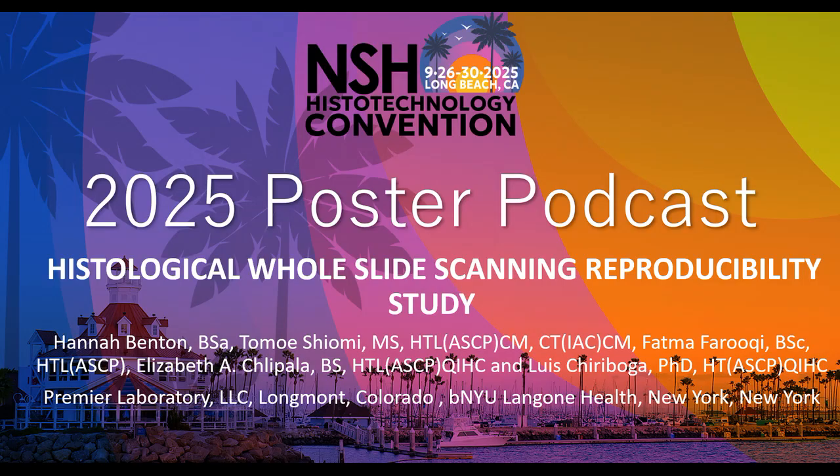Yeah, and one of the things you had talked about before was the difference between the eosin and the hematoxylin over the scanning period of time. Yeah, so what we found out is optical density for both hematoxylin and eosin decreased as the slide kept continually being scanned. But what happened is, as the optical density of the hematoxylin, the area of the hematoxylin decreased, the area of eosin actually increased slightly. And we're like, why is that happening? And I think it's because as the hematoxylin decreases, eosin can come through more. Yeah, through more. So that was kind of like, well, why is that happening?